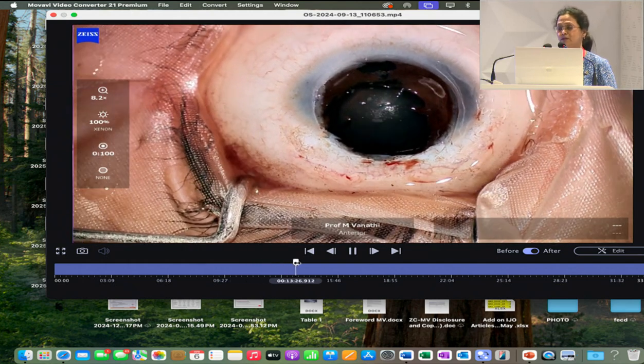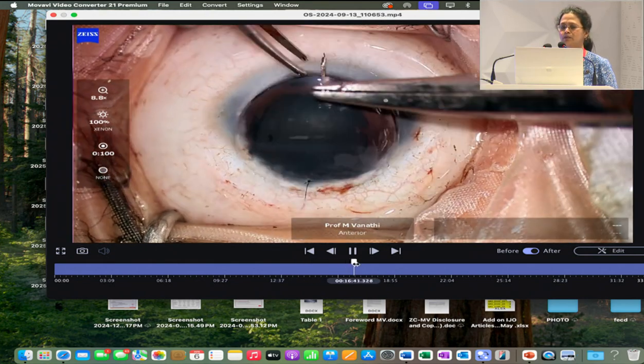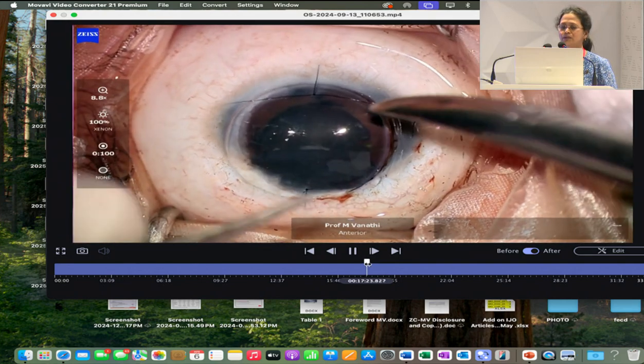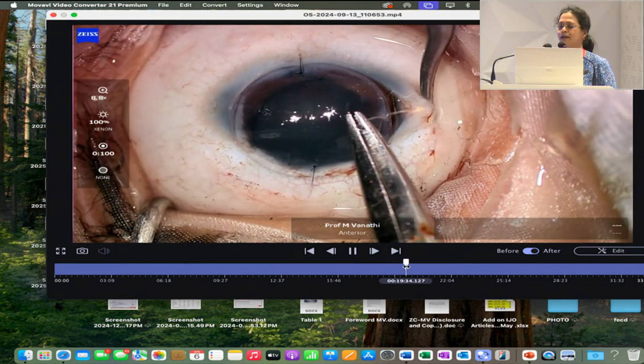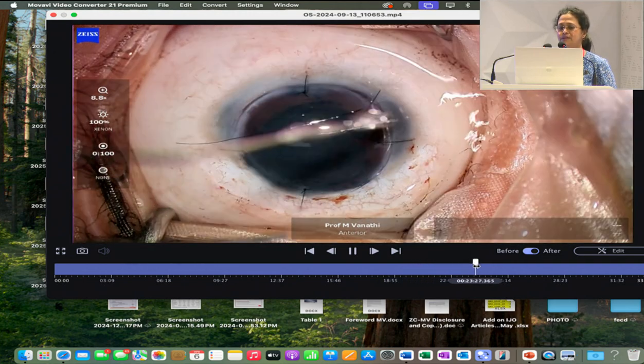The lens is not involved in this particular case, and there is a dilemma whether you would call these patients partial sclerocornea, or just a variant of Peters here. But I think the new classification comes to help. They just say it is anterior segment developmental anomalies here. So you go ahead and finish the surgery for this patient.